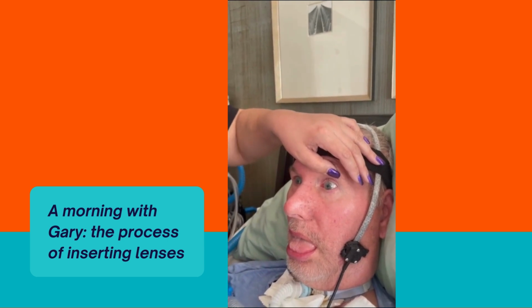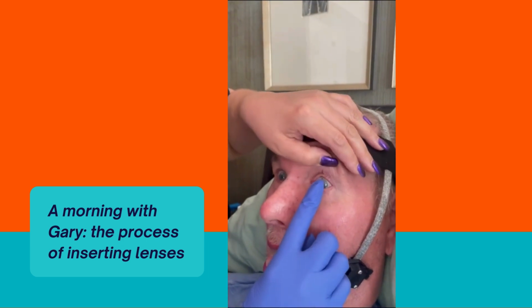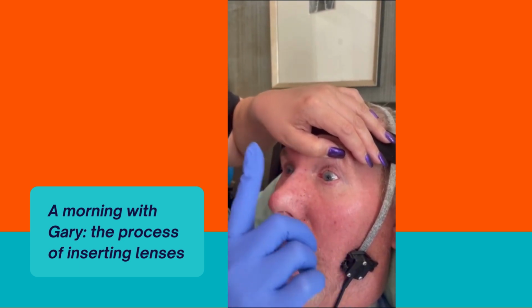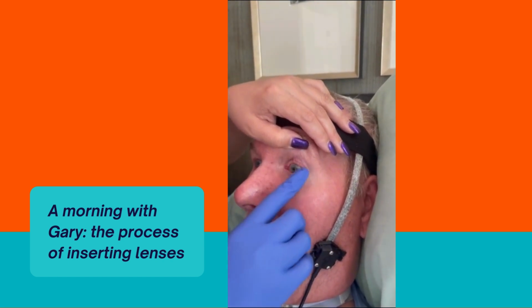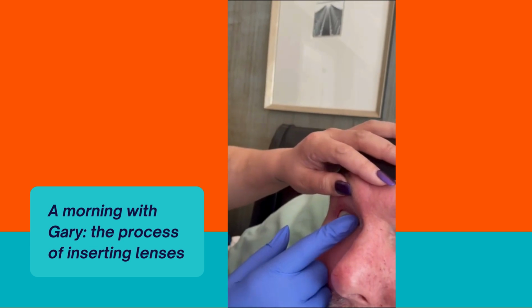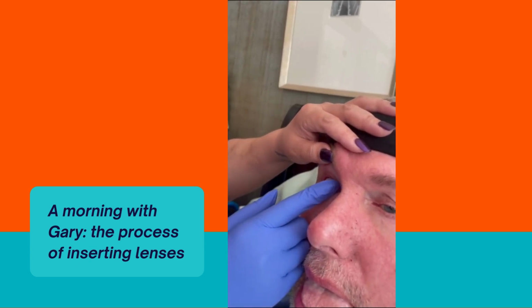When he wants me to wipe his eyes, we do this motion going from right to left, and we just hold the top open and dab. It's very, very light, or you can do a light swipe across with your glove or your finger. Just slight pressure. What that does is get any kind of film or debris that might build up. You want to be as light as possible in this instance, because if you apply too much pressure, you're going to end up getting a bubble. Some of your liquid will come out.